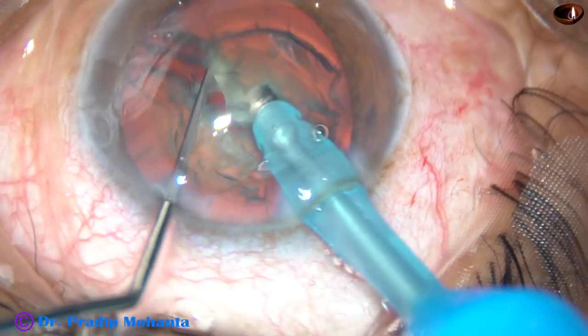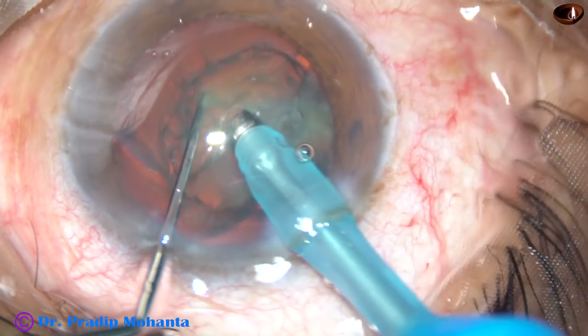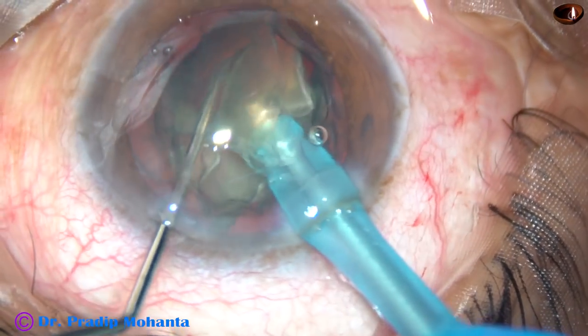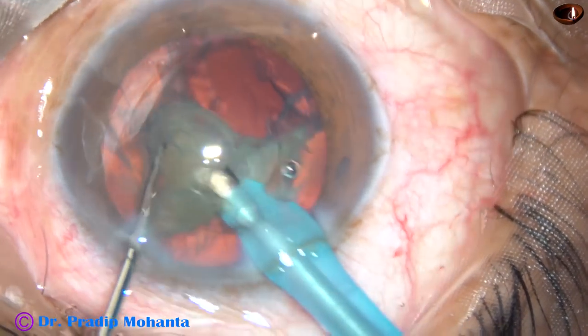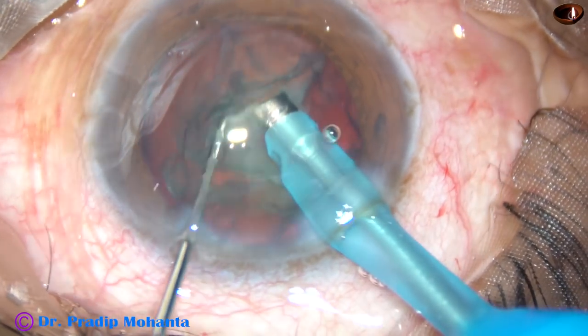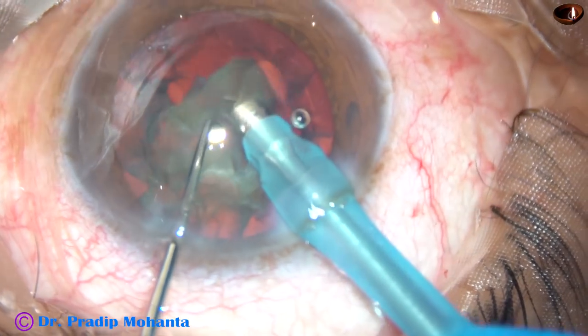The tip is buried into the substance of the nucleus. The nucleus is held firmly and it is chopped. It is chopped at another place. This free nuclear fragment is emulsified and engulfed. The nucleus is being chopped and engulfed.